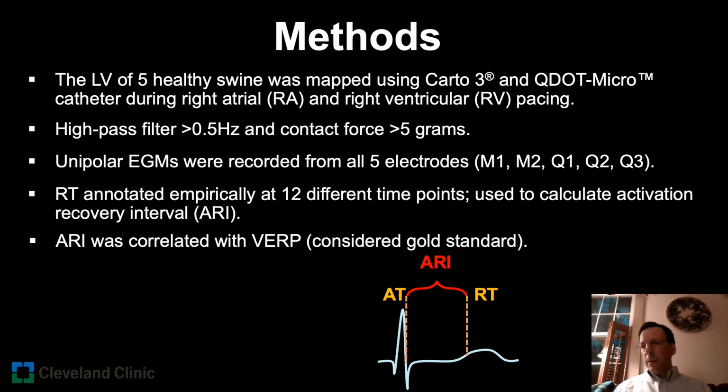And finally, we compared the ARIs with measured ventricular effective refractory periods. These VERPs were used as a sort of ARI gold standard for the purposes of these experiments.